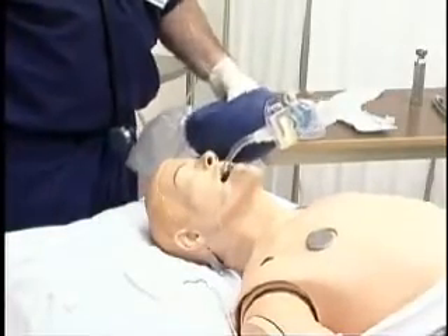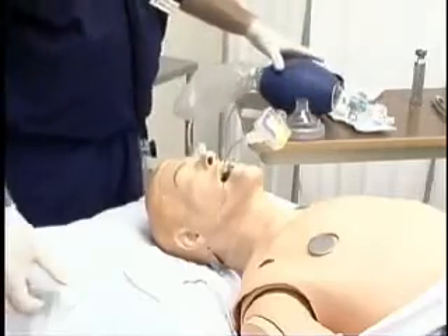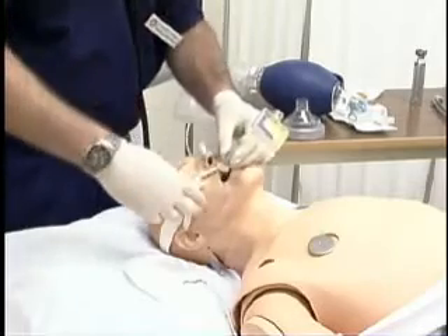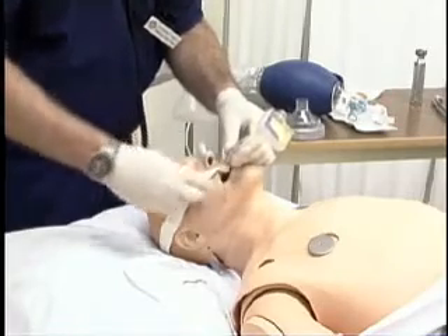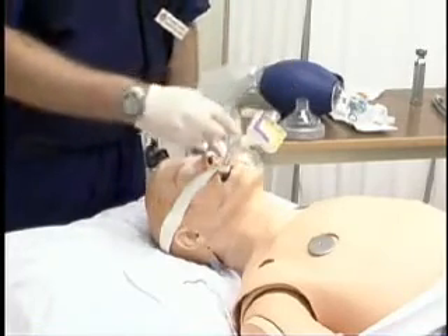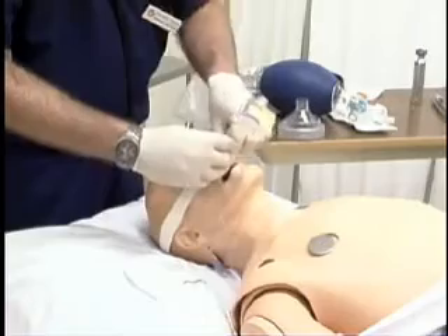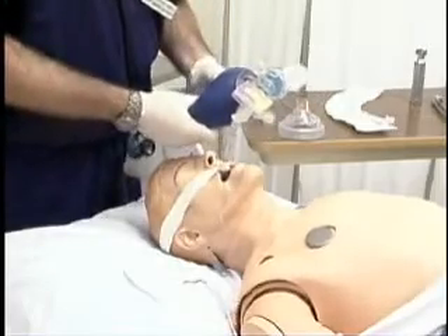Once placement is confirmed, we're going to secure the airway. I'm going to remove the manual resuscitator bag for a moment and quickly secure this airway. I want to make sure not to tape the lip to the endotracheal tube — otherwise you'll damage the skin of the lip and could tear it. So you just want a nice snug fit, not too tight. There are several different ways to tape an endotracheal tube — we'll follow the policy your hospital has. We use cloth tape and it holds the airway real nicely. Notice I'm taping around the endotracheal tube, but not taping the patient's lip to the tube. After we've attached the tape, we'll attach our manual resuscitator bag back and begin to ventilate the patient.